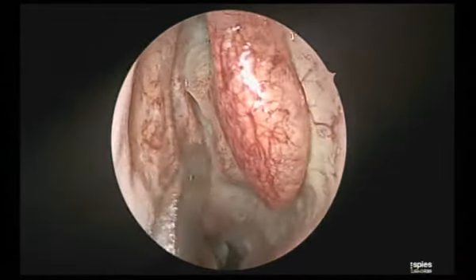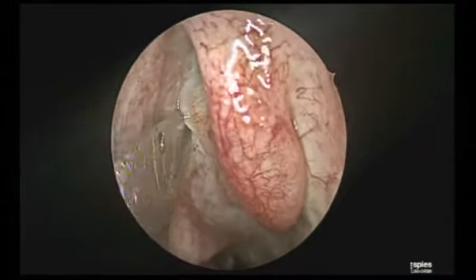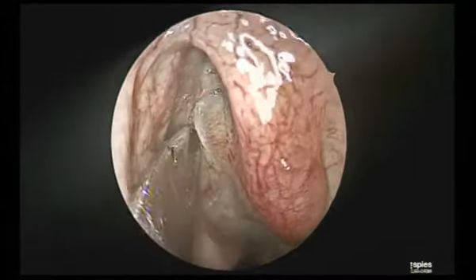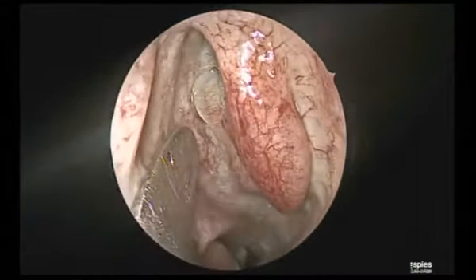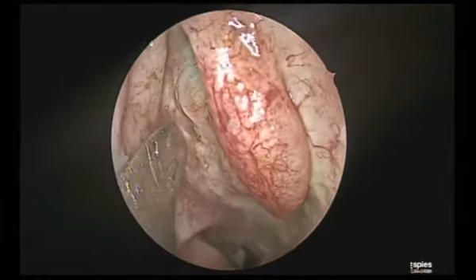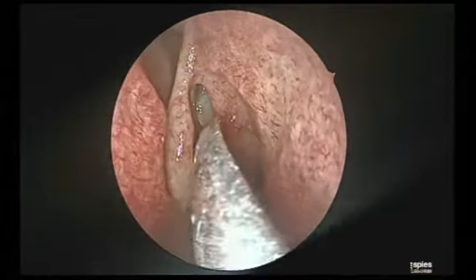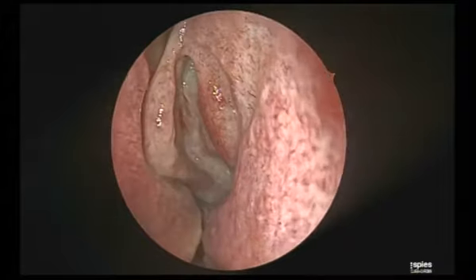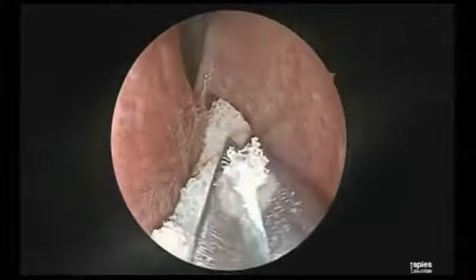All the way posterior, you're taking your periosteum elevator inferiorly, almost to the ground lamella, and I am giving little micro fractures to the inferior part. Can you see? Without destabilizing or doing anything with the superior part, this is literally called micro fracturing, in which the surgeon can appreciate the clicks, the crackling there. And once you do this and pack this with a Merocel for a minute, your middle turbinate will never come here and there during the surgery.